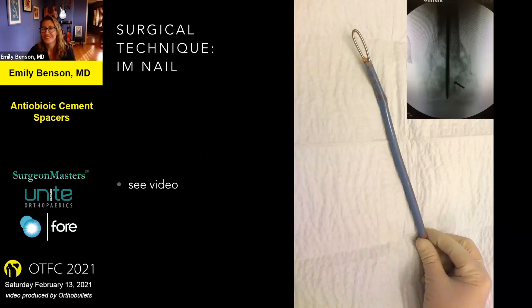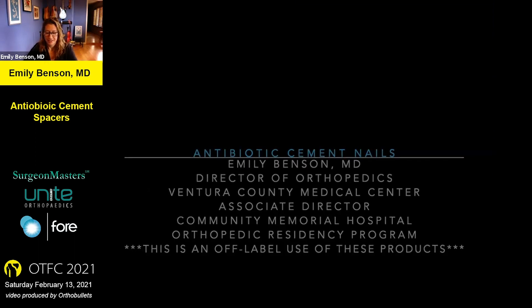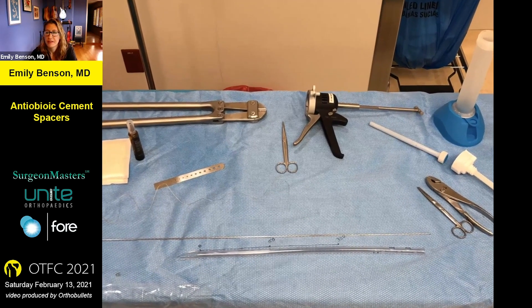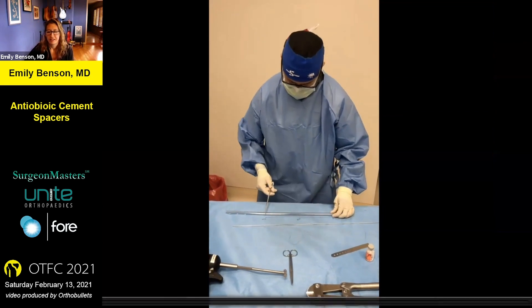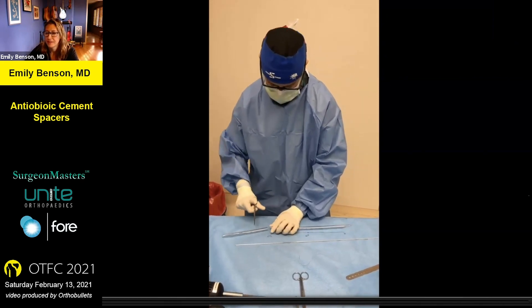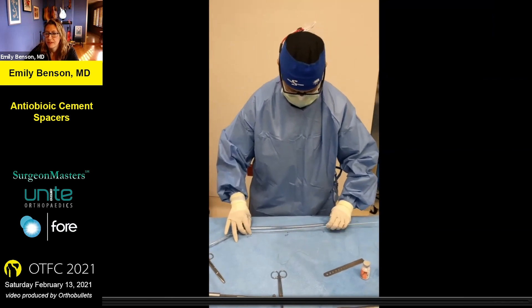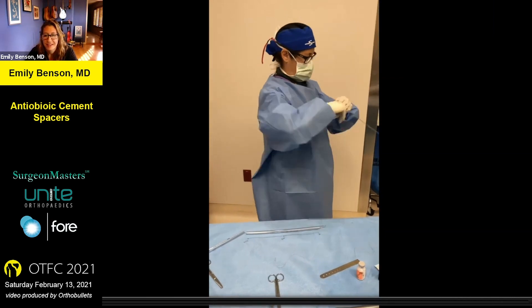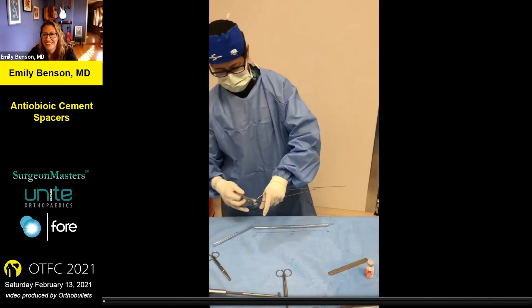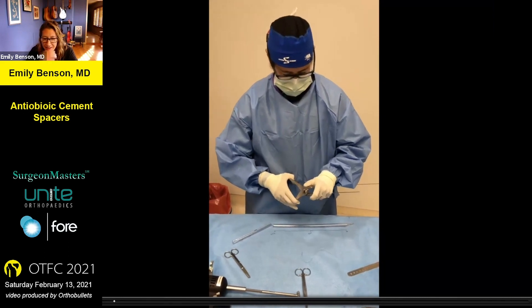I made a video to show you how I like to make my antibiotic nail. The items you see on this table are really the only components required and likely exist at your institution already. First, I draw out on the back table the exact length I'd like the nail to be. The large-diameter chest tube is cut to length so that the portion with holes is removed. The ball-tip guide wire is measured against the chest tube and bent to provide a hook on the end of the nail, large enough for a bone hook for later extraction. The guide wire is bent and clipped — it's important to pinch it slowly so it bends rather than breaks, which is particularly a problem with refurbished guide wires. The guide wire is then used for internal rebar support, with the ball tip at the distal end of the nail.